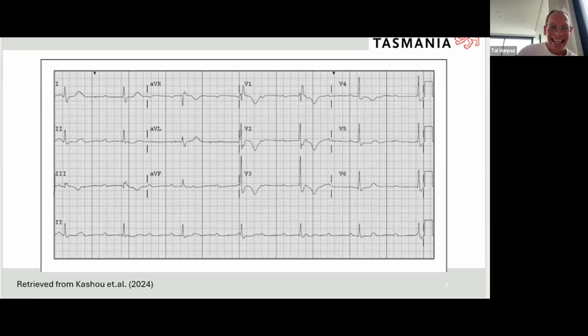Somebody else has to say. Atrial 100, QRS 40, fantastic. Harper, yeah, absolutely. Problem with the AV, absolutely. Madeline, AV block, yeah, absolutely.